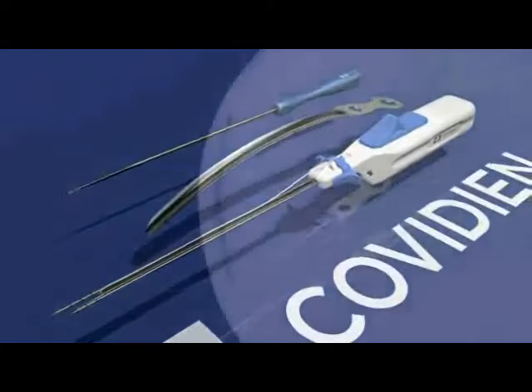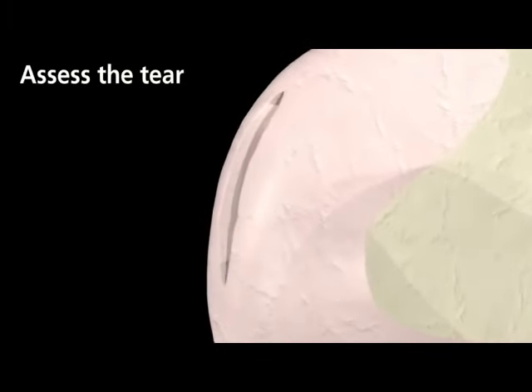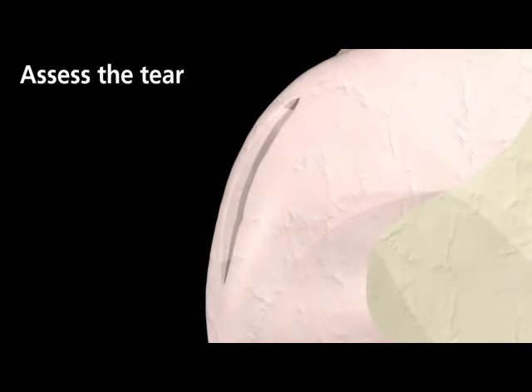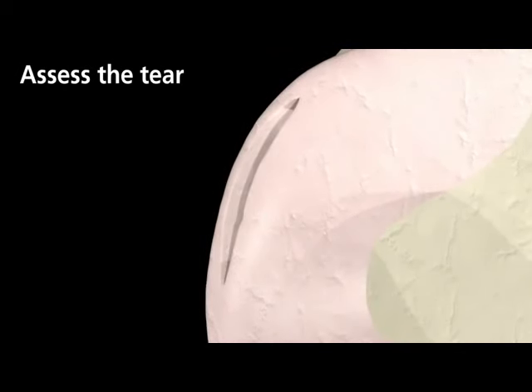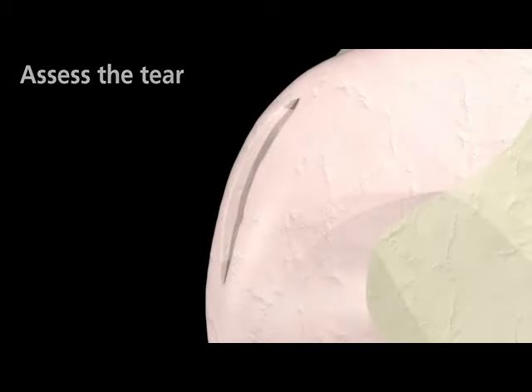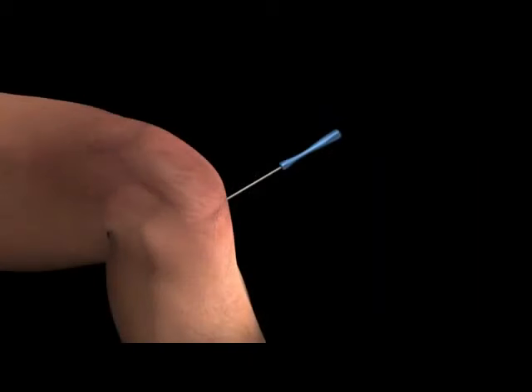Meniscal Repair: Under arthroscopic visualization, the meniscal tear is probed to determine if it is suitable for repair. If repairable, the tear is prepared using the surgeon's preferred methods.